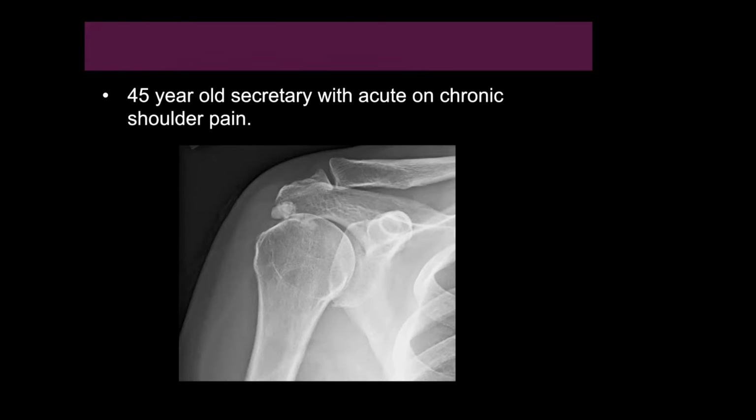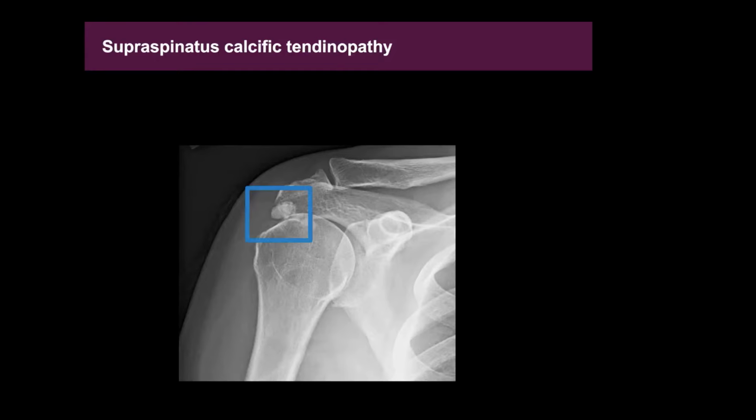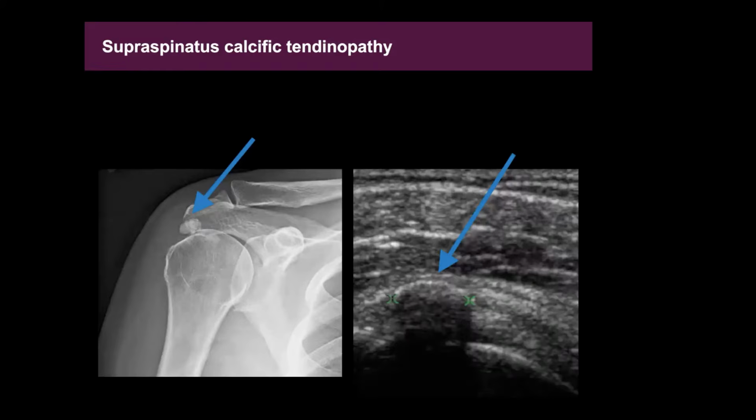And you can see, there's really no need for ultrasound in this case if you're just trying to make a diagnosis. Well, that's calcific tendinopathy. I think everybody could see that. So where does ultrasound come into play in this case?